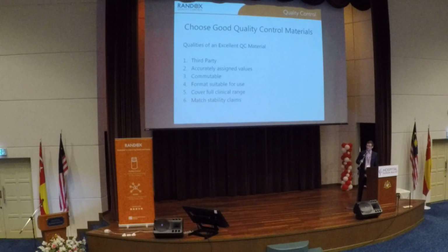So these are all the things we need to think about when choosing a good quality control. I read an article by Westgard recently, and they said it's possible to do the right QC wrong and to do the wrong QC right. So what do they mean by that? What they mean is you can buy the most high quality control product in the world, and you can use it in the wrong way. Similarly, you can buy a very cheap QC product that isn't very good, and you can use it in exactly the right way. But if you do either of those things, the results you're going to get will not be very good.